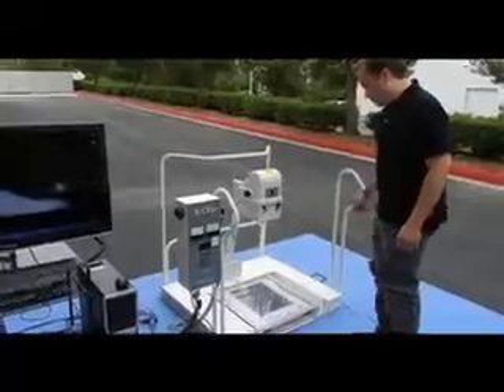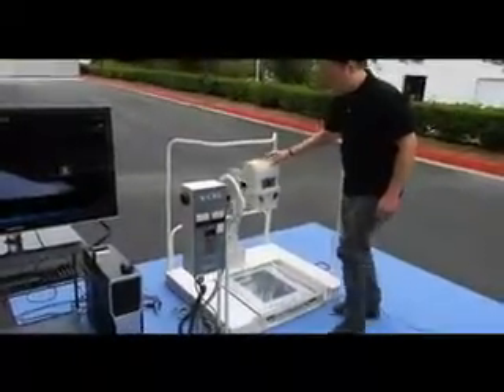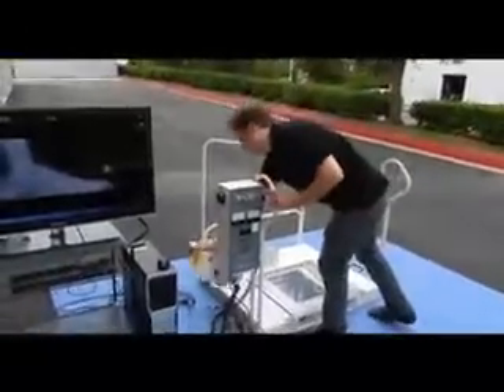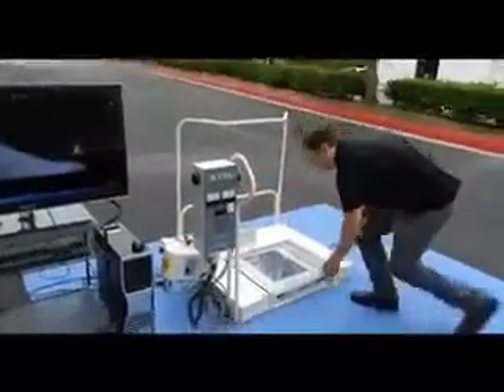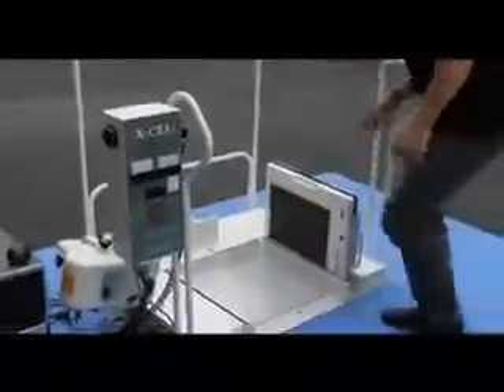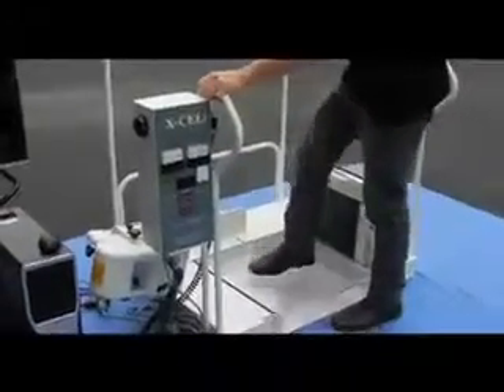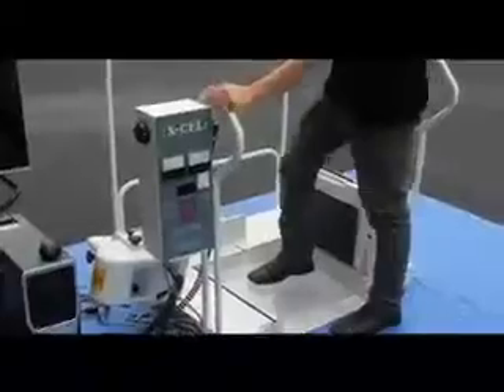Also, what is great about this system is that the tube head moves side to side, so you could drop the tube head down at whatever angle you need to take whatever shot is required. Take the DR, pop it over here, and you have every shot that is needed for a lateral or any other angle that's needed.